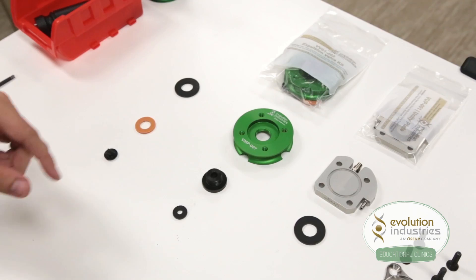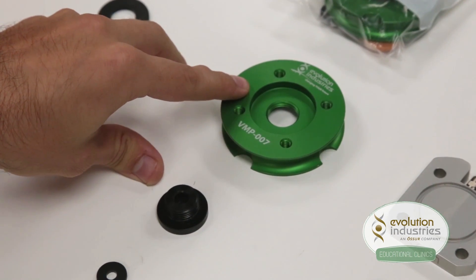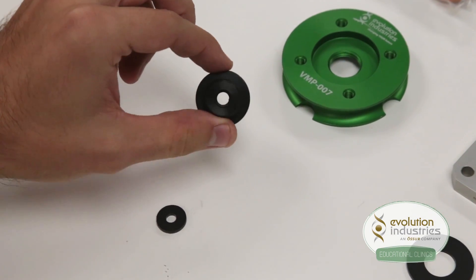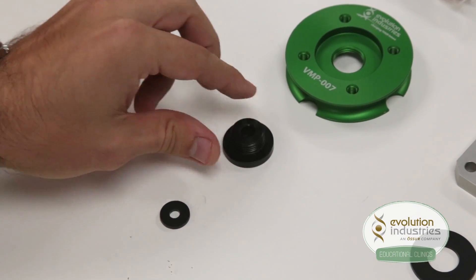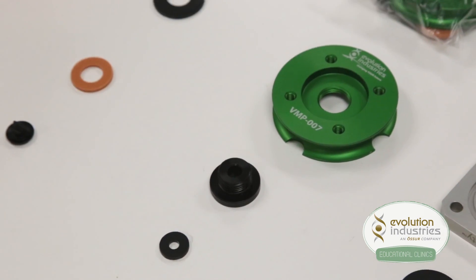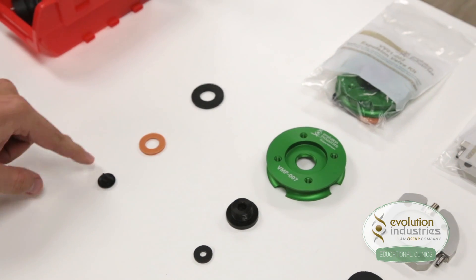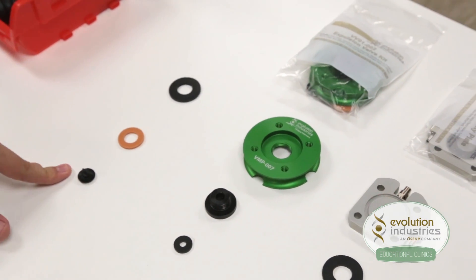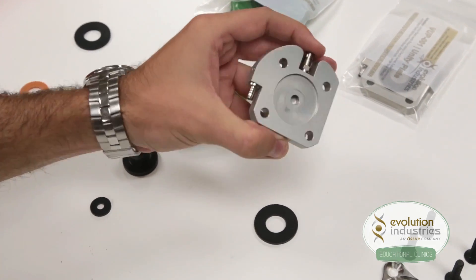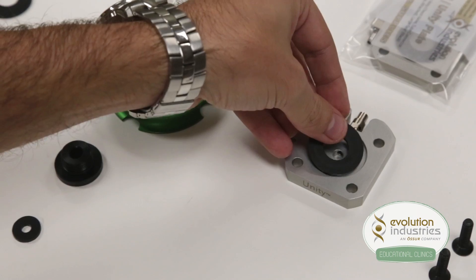From your expulsion valve kit, you will be using the valve plate, part number VMP-007, the expulsion valve housing, part number VV03-001, and the small seal. You will not use the large seal, the orange seal, or the one-way duckbill valve. Your Unity Plate will come pre-assembled and includes a large seal to fit into the recess.